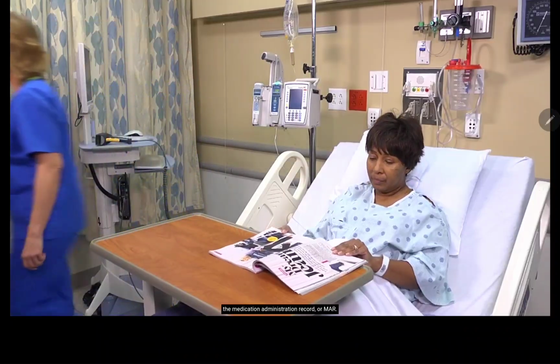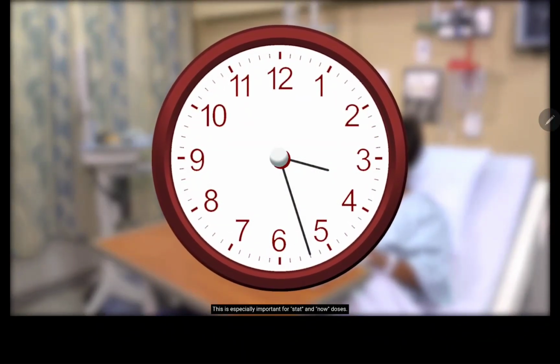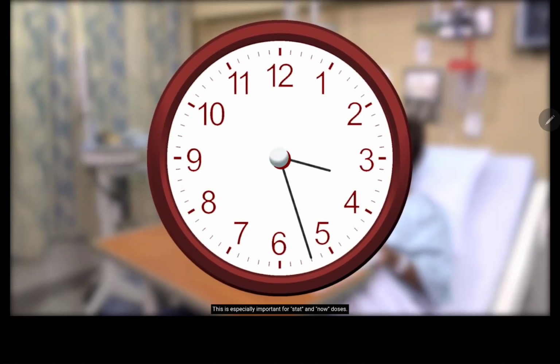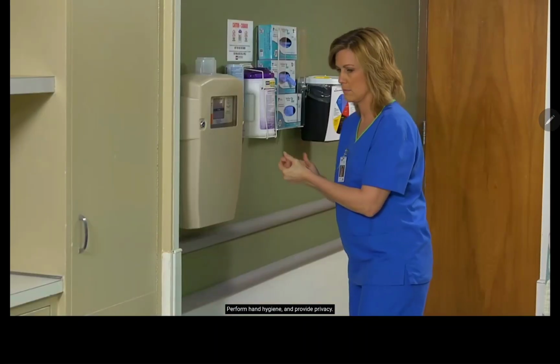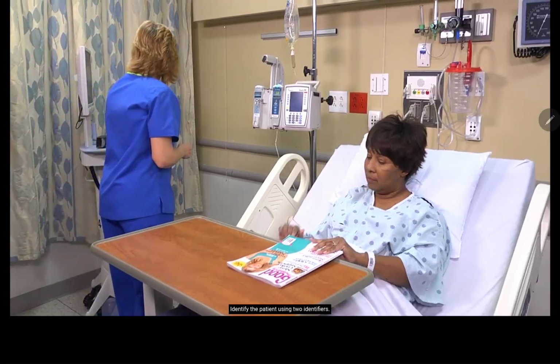Administer the medication at the time ordered. This is especially important for stat and now doses. Perform hand hygiene and provide privacy. Identify the patient using 2 identifiers.